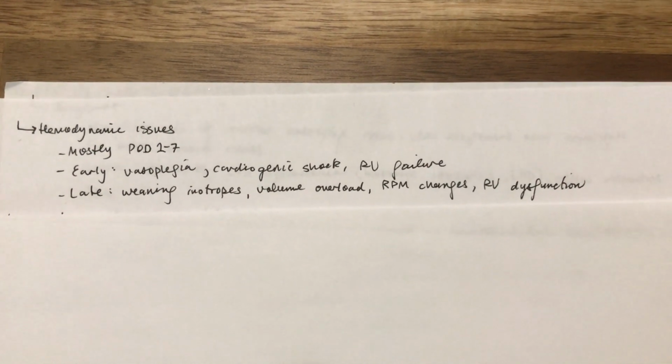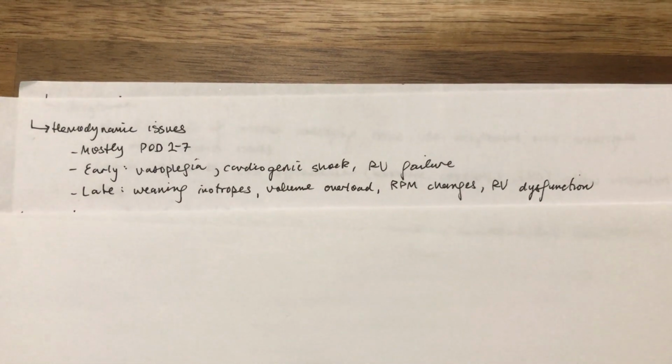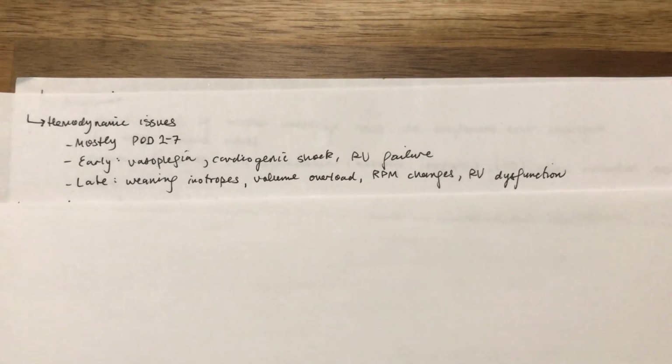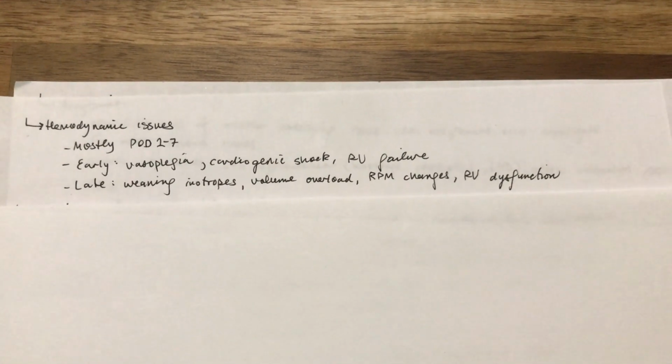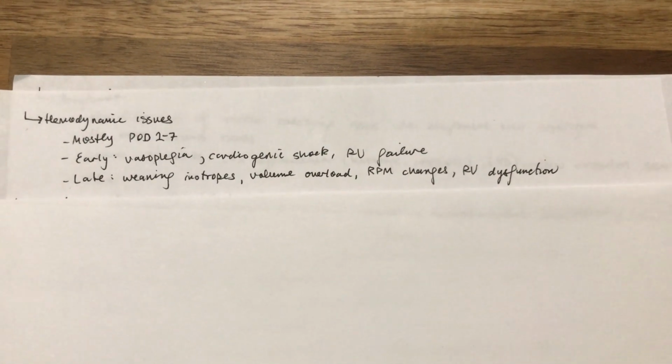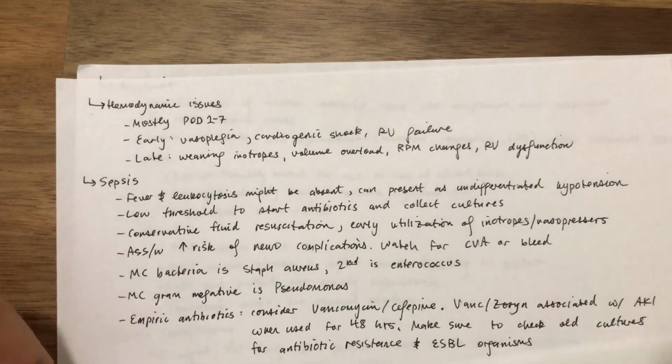I think early in their course, you tend to see vasoplegia, cardiogenic shock, and RV failure. Later on, you tend to be weaning the inotropes, diuresing them, and then fine-tuning RPMs and tracking any RV dysfunction to make sure it's not getting worse. So look at their chart, look at the notes. It just might be the patient's adapting to the VAD. For how complicated they are, sometimes the answer is quite simple.